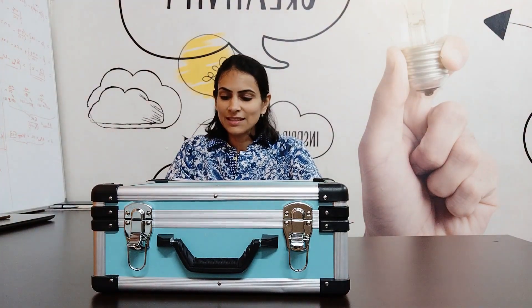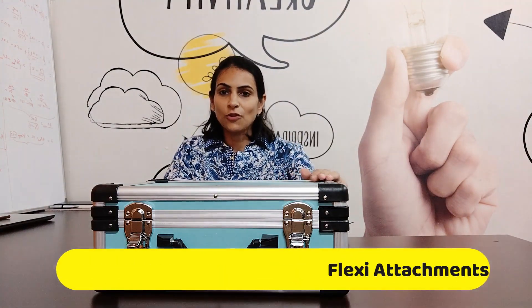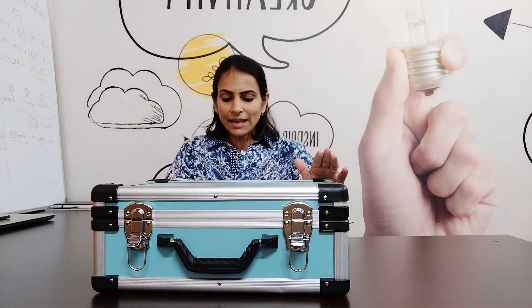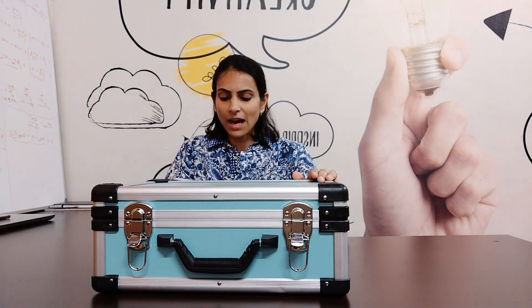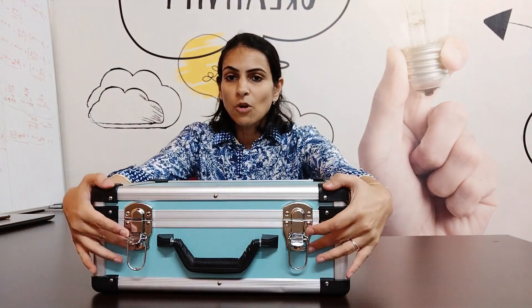In the world of orthopedic surgery, precision is paramount. Introducing the IAOS multipurpose power tool, the ultimate solution for orthopedic surgeons seeking excellence in their procedures. With its cutting-edge design and state-of-the-art technology, this power tool empowers surgeons like never before. Let me show you what this box has.